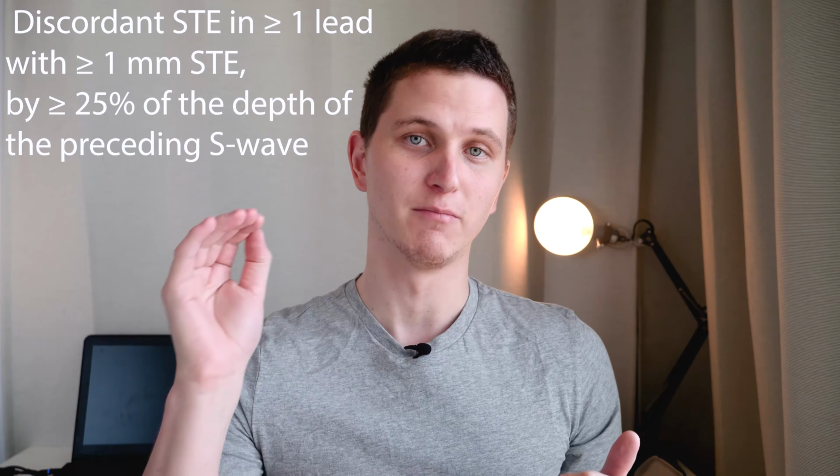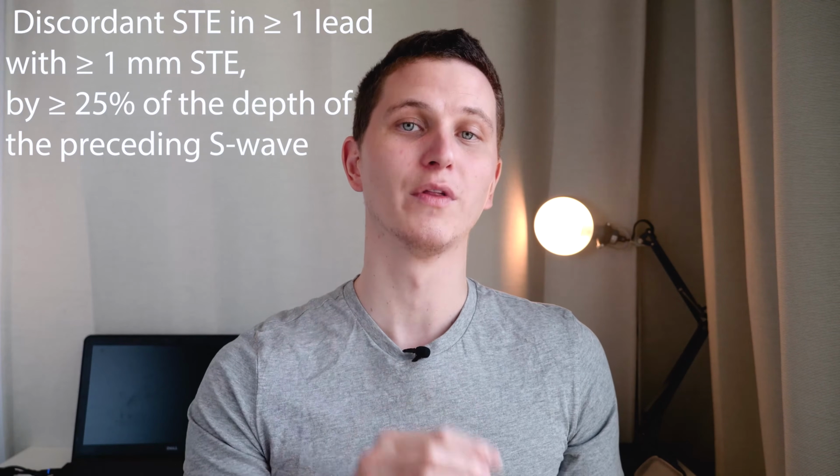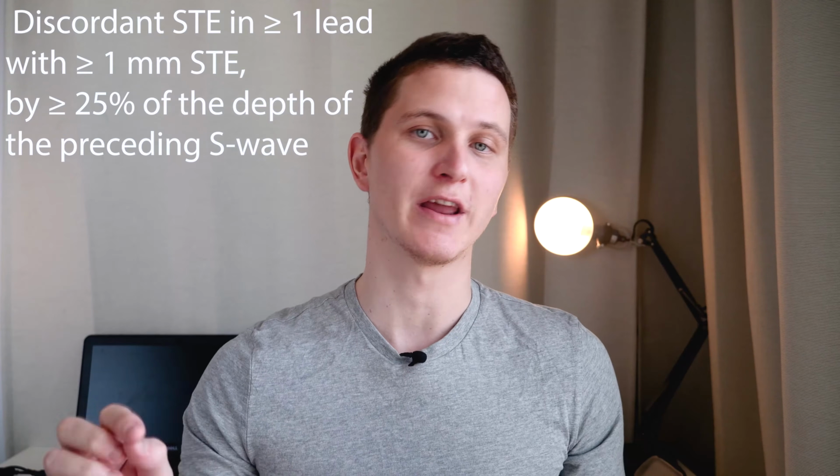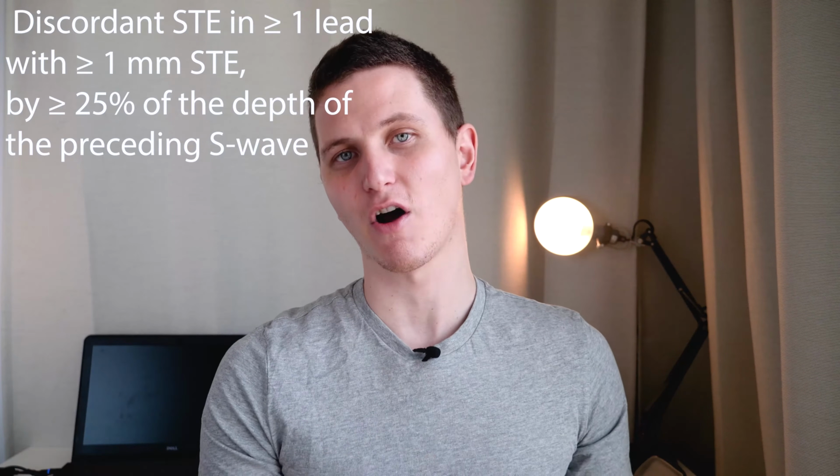Your third criteria for your Sgarbossa criteria is that you have discordant, meaning that your QRS can be negative and you have ST elevation of more than 1 millimeter in more than one lead that is at least greater than 25% of the size of the S wave.